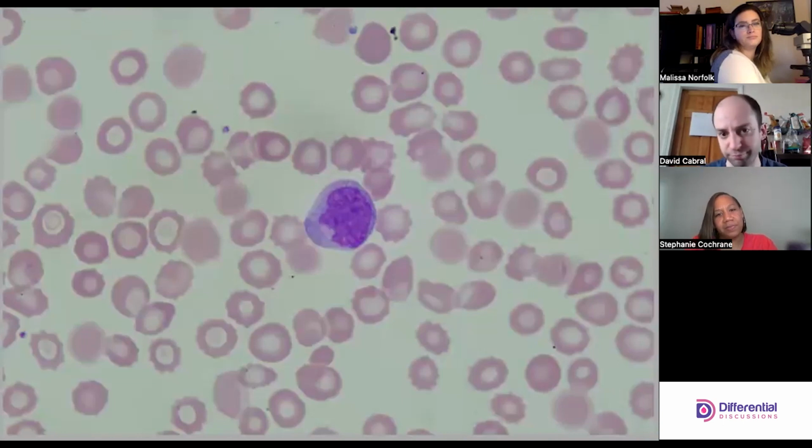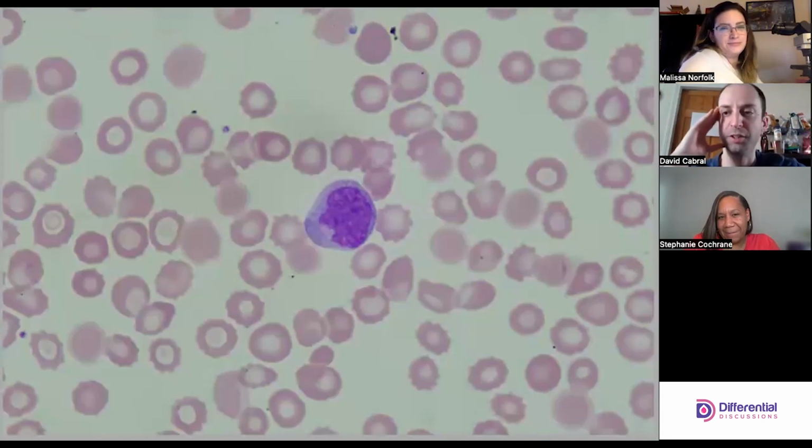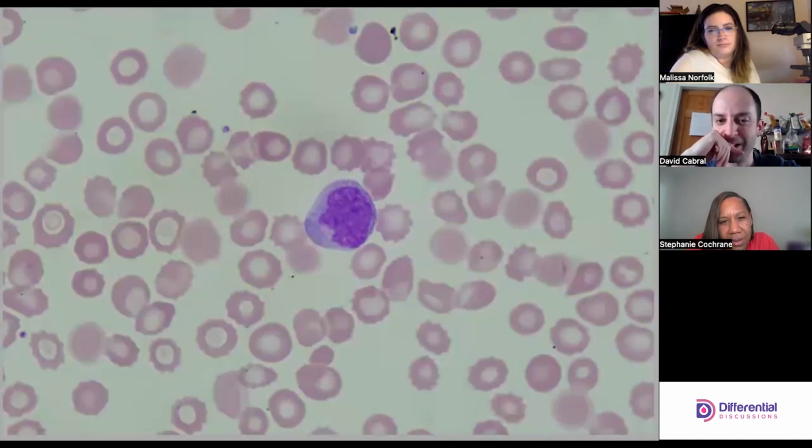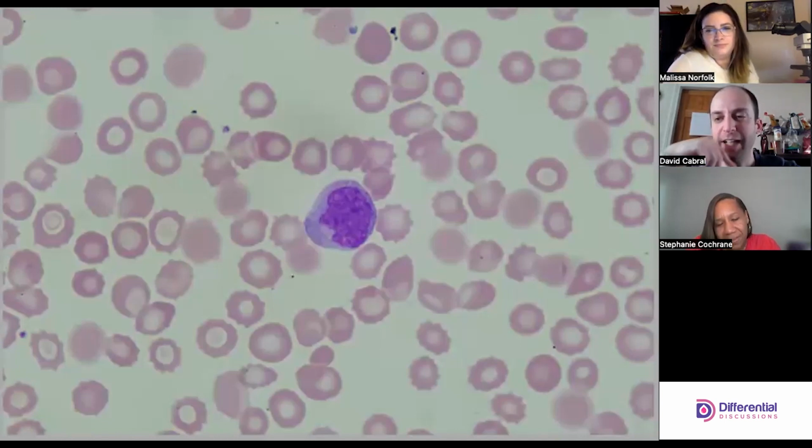Monocyte, I suppose. I don't know. PDs are annoying too, not gonna lie. I'm looking at the chromatin pattern and I don't think that's a nucleolus at the top, but I see what you see. It's tough. The cytoplasm is throwing me off.